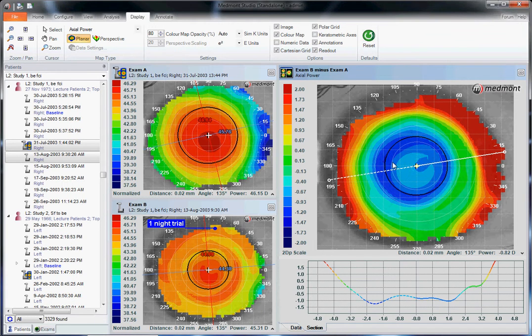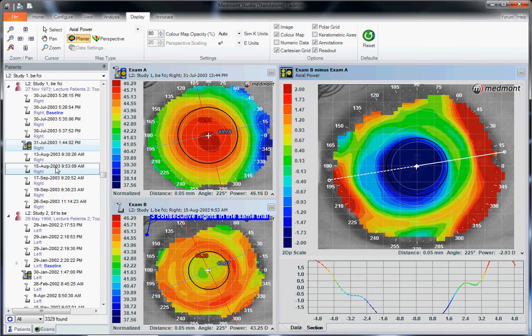Now let's go from one night where we have very little effect centrally, more effect peripherally, and go to a few more days of treatment. You know that orthokeratology full effect is seven to ten days, so after one night such as this case we may not be getting the full picture. Let's go to the next visit which is three consecutive nights, and we see on the axial map a blue treatment zone that's begun to fill in very nicely. We've gone from 0.82 diopters central effect to 2.9 diopters treatment, so orthokeratology is beginning to create much more effect as we allow it more time.